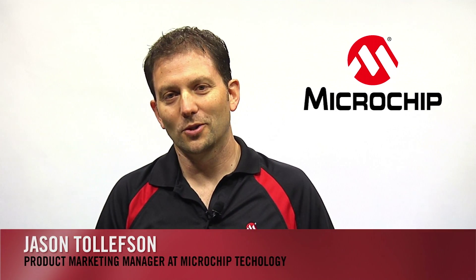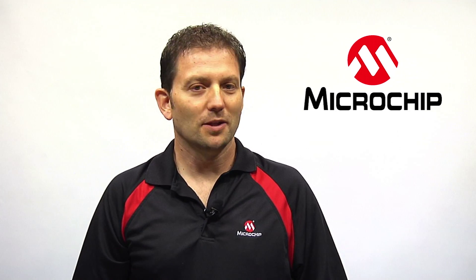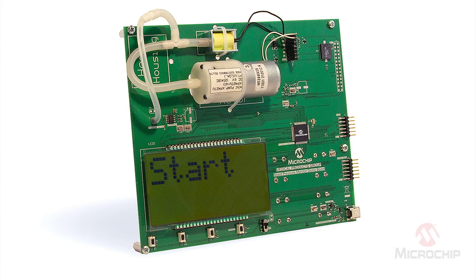Hi, I'm Jason Tollefson, Product Marketing Manager at Microchip Technology. I'm going to show you Microchip's blood pressure demo. This reference design is powered by the PIC24F GC family. The MCU drives all the parts of the board and measures the pressure too.